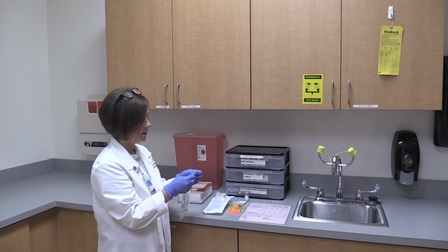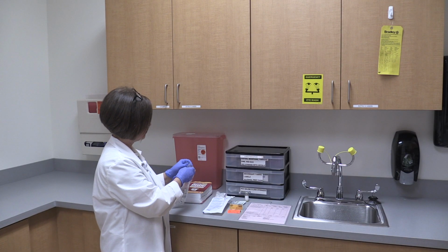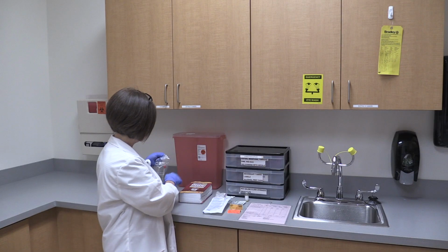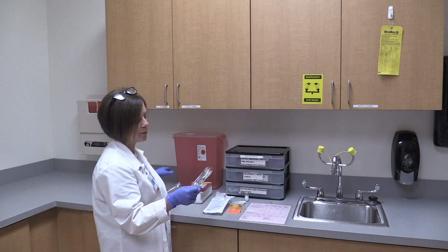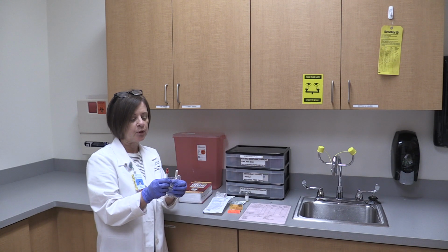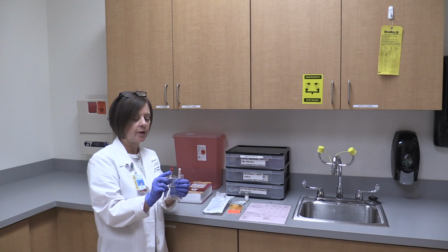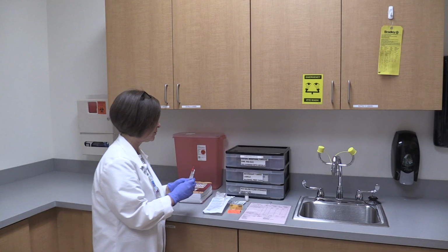Now open my saline. When I open this, I'm going to check the expiration date. I'm going to make sure that the solution is nice and clear. I'm noticing that I have 2 ports. This is where I will spike the IV tubing, and this is where I'm going to insert the medication.